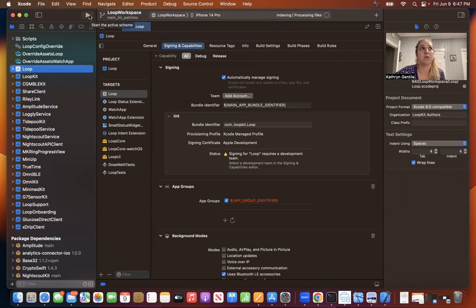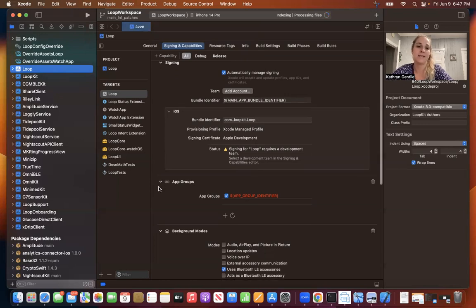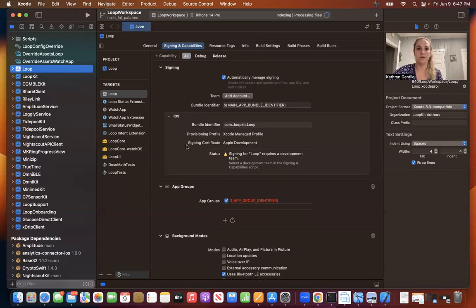It might come up that you need to download a watch simulator. If that comes up, you do need to do that in order for Loop to build. And then hopefully it builds successfully. If you have build errors, well, then you go into the docs and look at what possibly could have caused the build to fail. And reach out to the community if you need to.